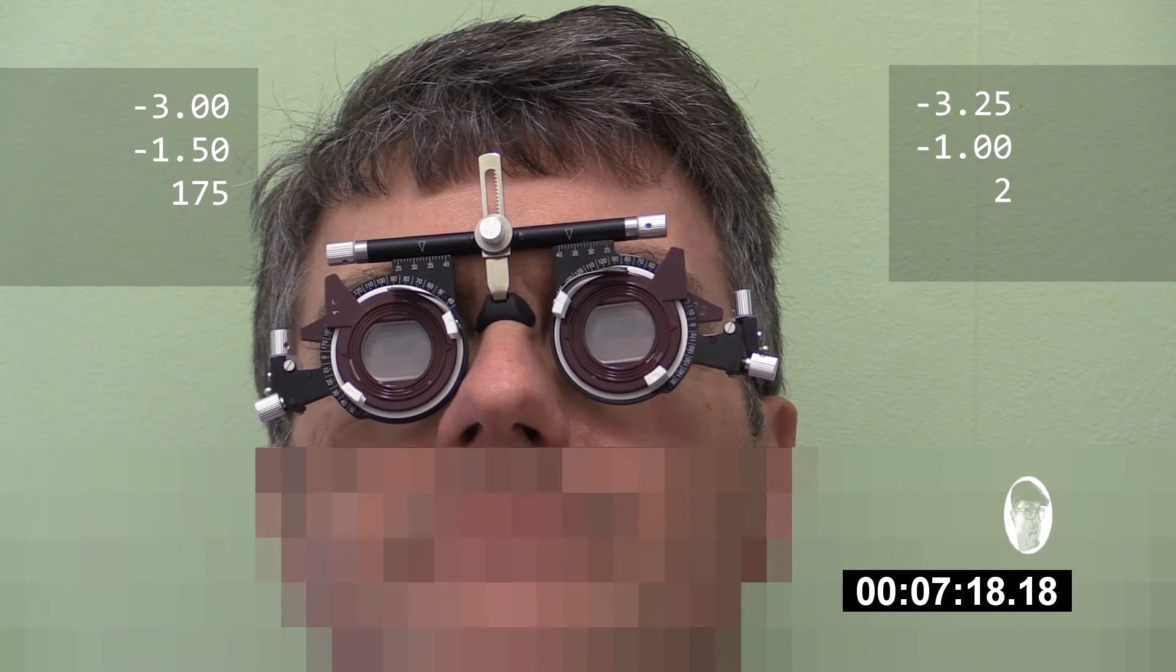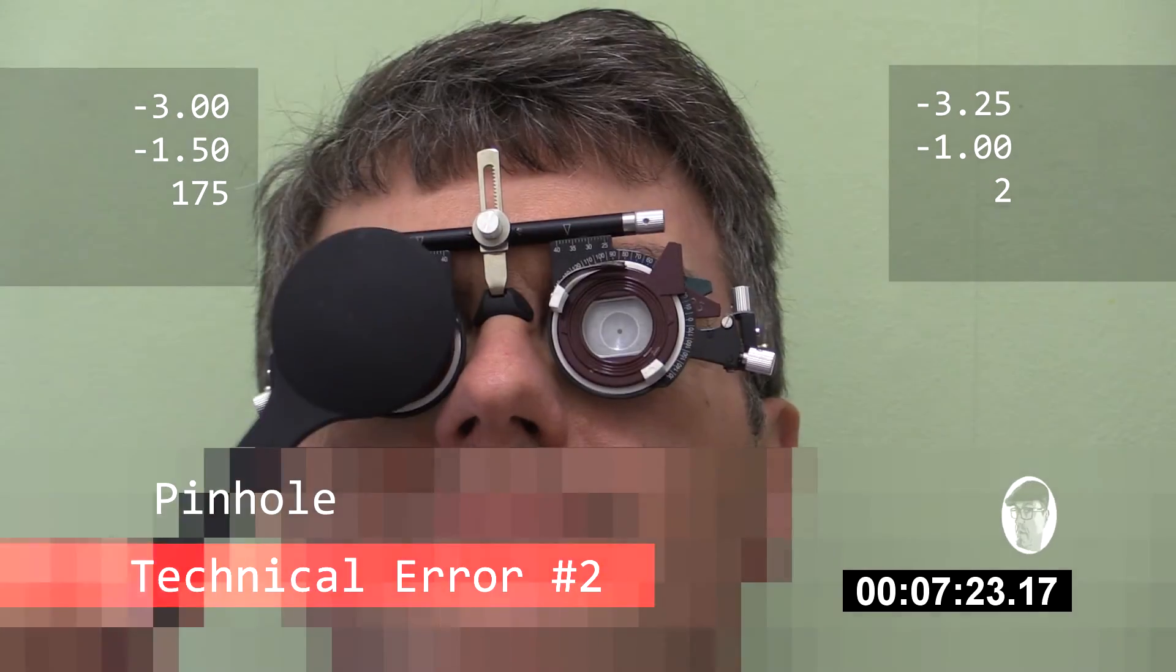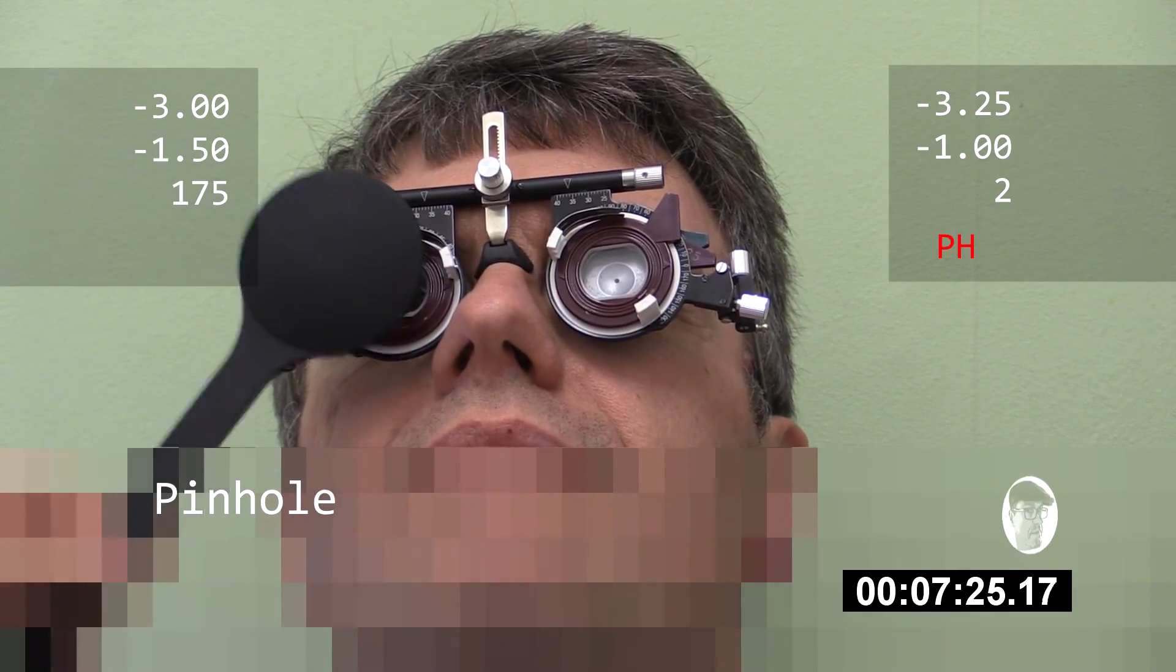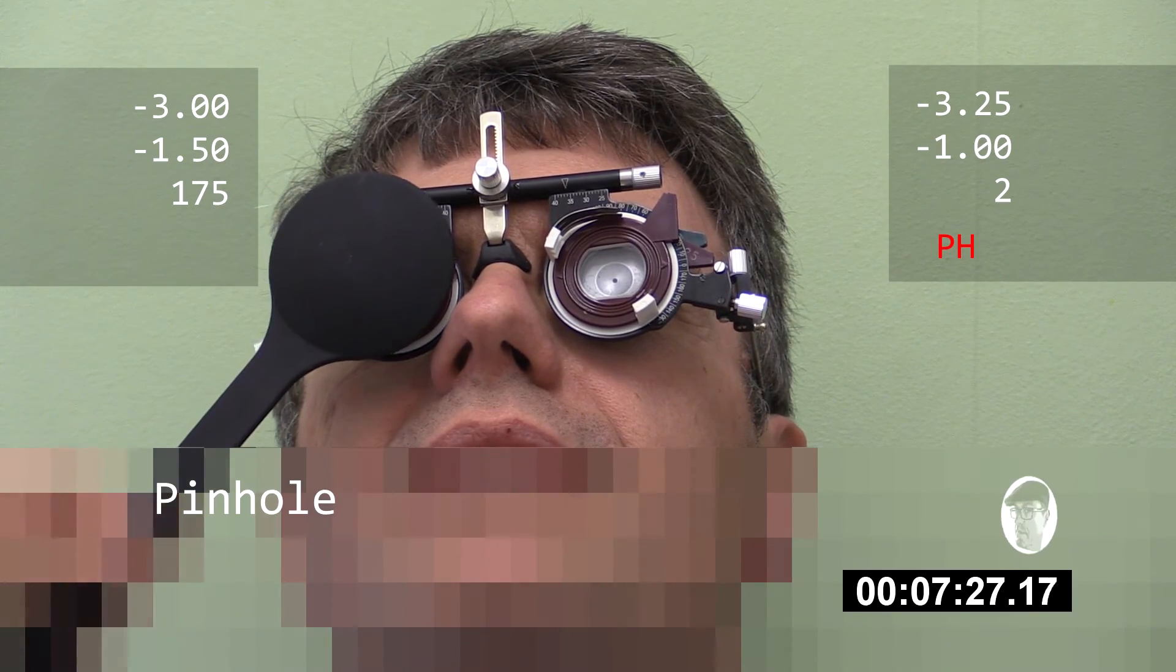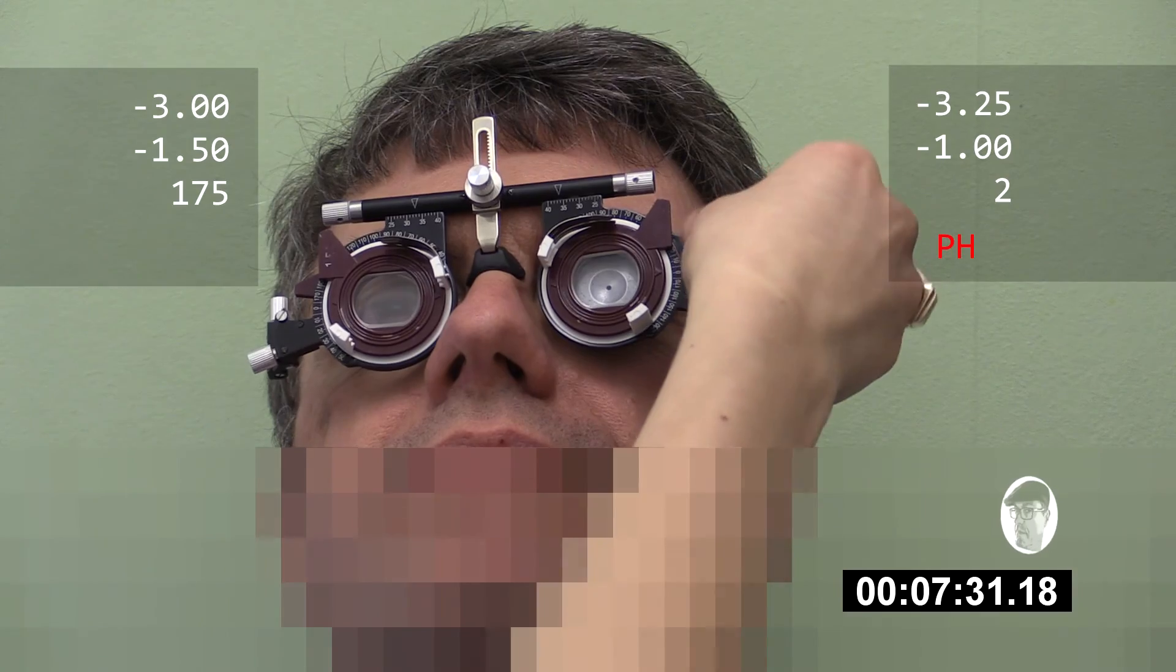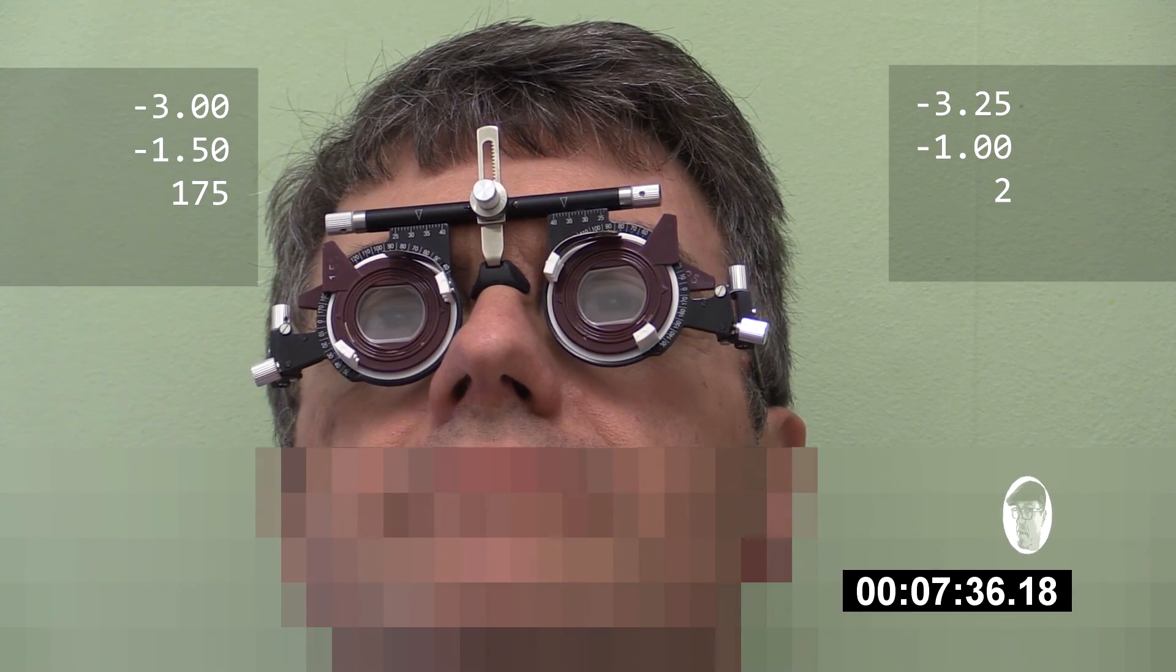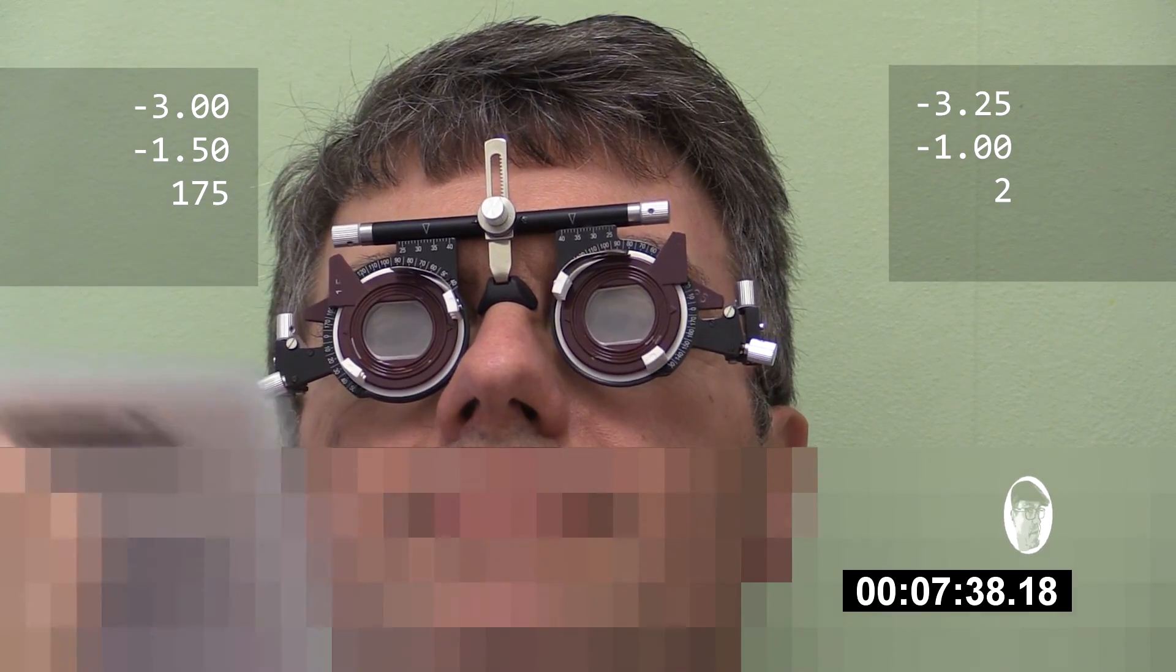Can you see any clearer with that pinhole? Yeah, you have to adjust it a little bit. Yeah. Or is it about the same? Yeah, it's about the same. About the same. Okay. Okay. We'll leave back there now, and go to our reading chart.